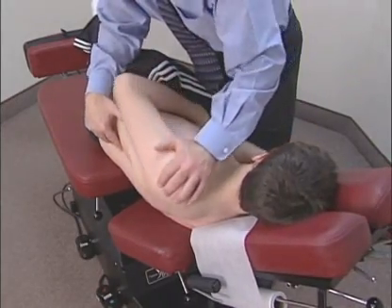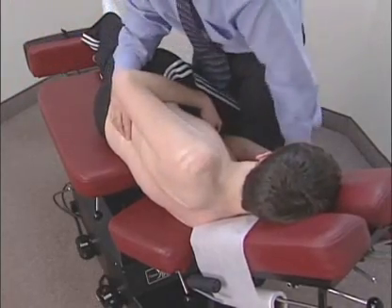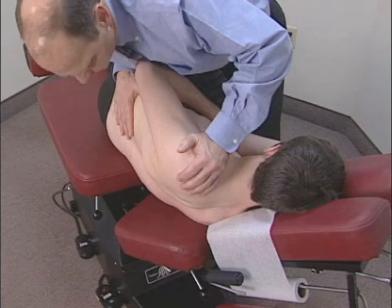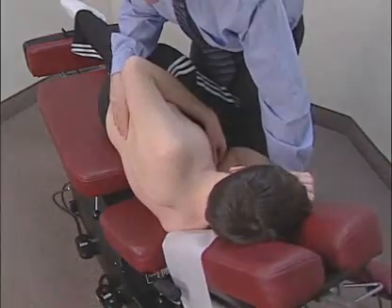It is very important to lean over the patient, using your body weight, not arm strength, when applying corrective thrust or force. Notice how far the doctor is over the patient. When the patient relaxes and the lumbar spine is flexed, apply your corrective adjustment. With a little practice, you will be adjusting your largest patients with ease.